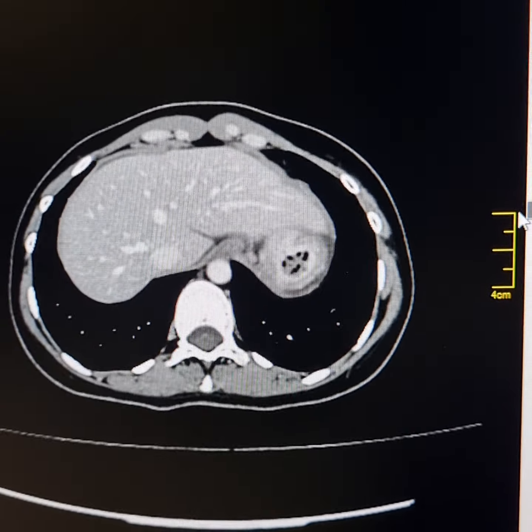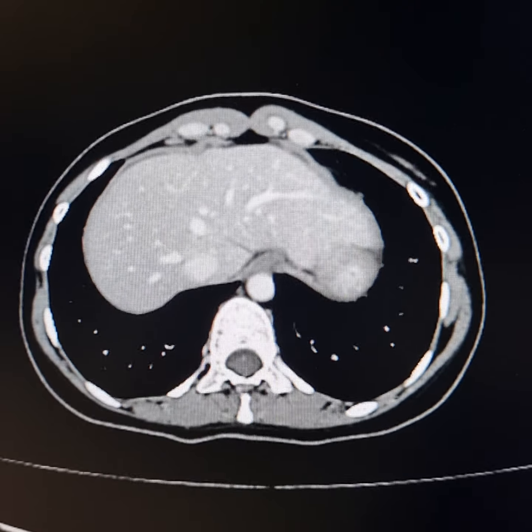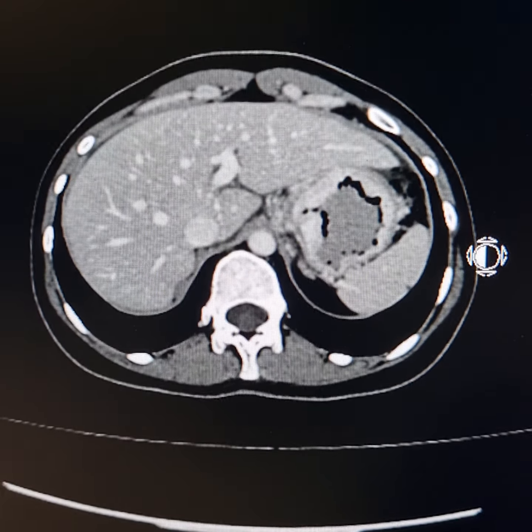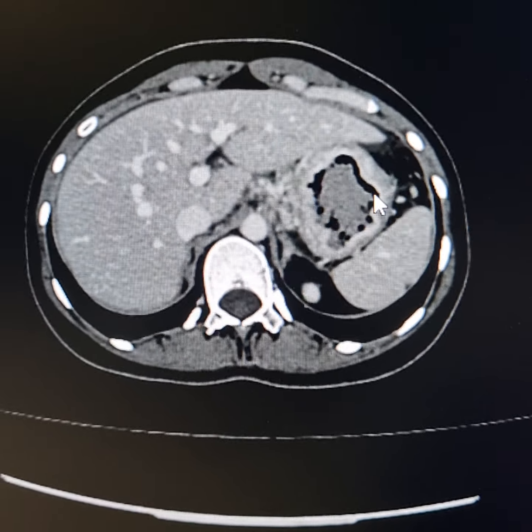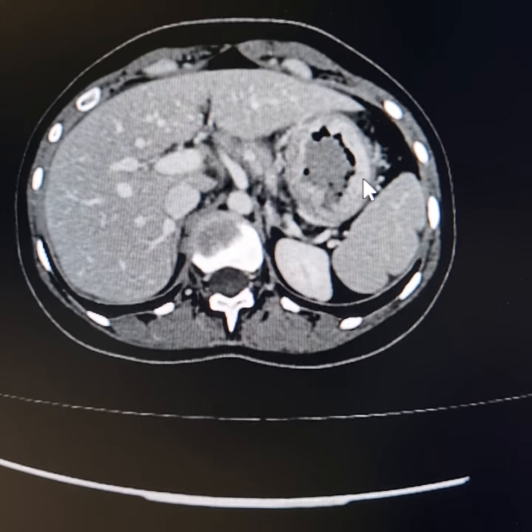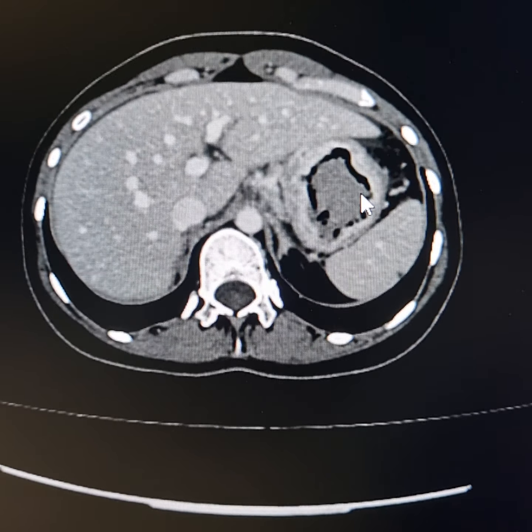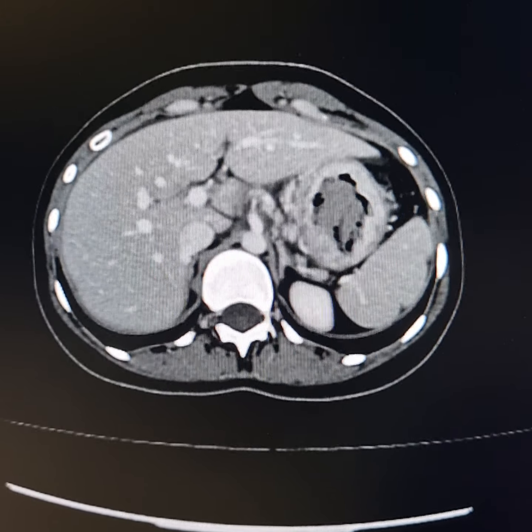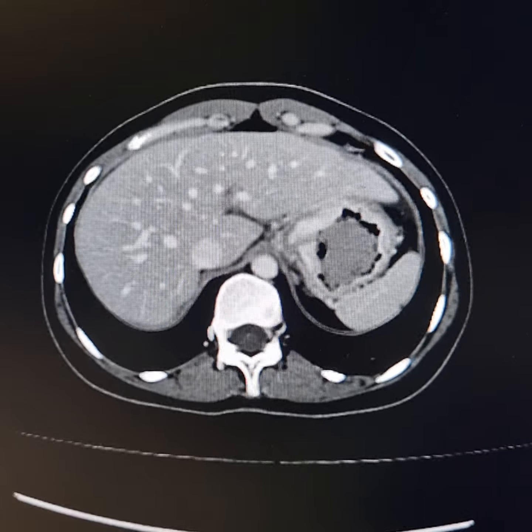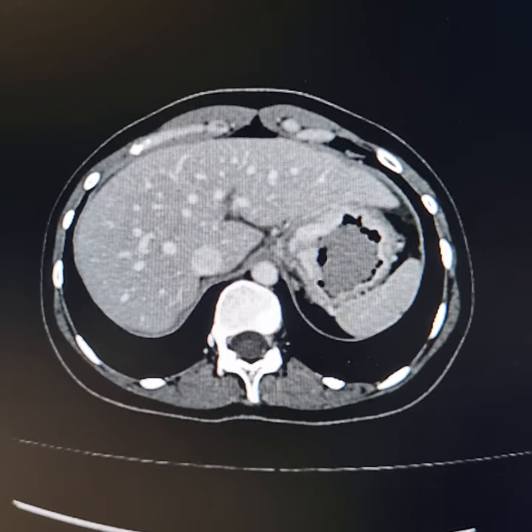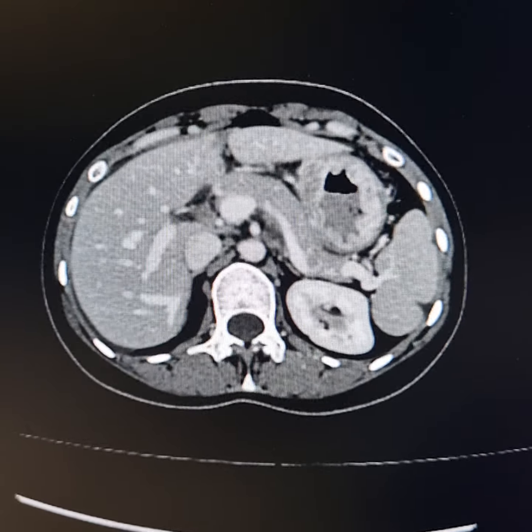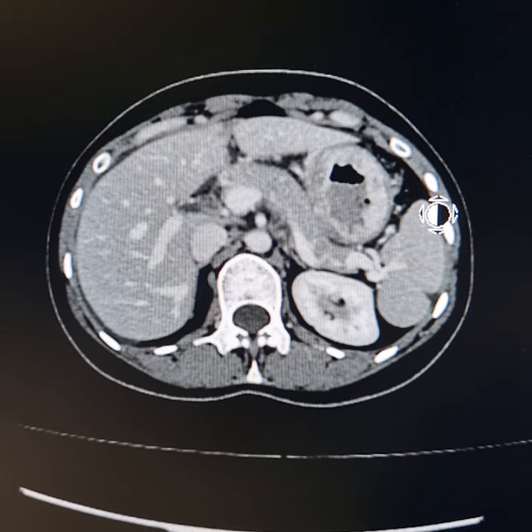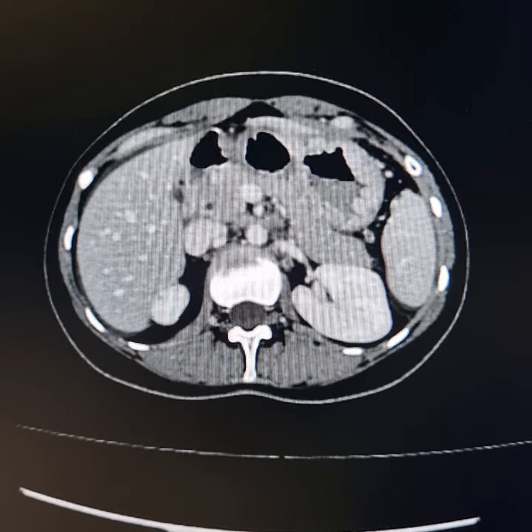Please observe diffuse thickening of the walls of the fundus and body of stomach. The rugae are blunt at places; there is effacement of the rugal folds. This is a relatively small-sized body of stomach. Please observe non-homogeneous enhancement, density of adjacent fat, and slight stranding.